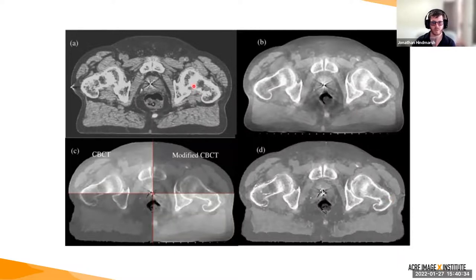All right, so cone beam CT, it is a form of CT made using a cone, so using the KV system that's most commonly perpendicular to the main beam line, and that's the image we get out from a cone beam, and that is a standard CT there. So you can see there is contrast and imaging differences between the two. You can also see that there are differences in the patient anatomy. So this is why we use this 3D imaging, because it shows us internal differences and changes that have occurred. And so this is a matching of the images to get us our final treatment location. That's when we shift the patient.